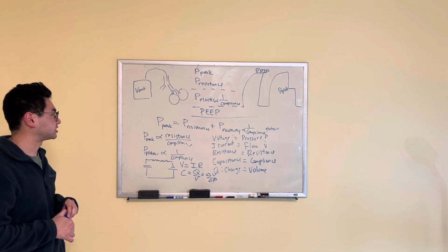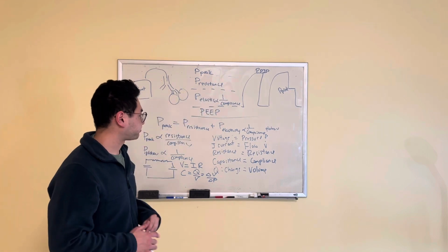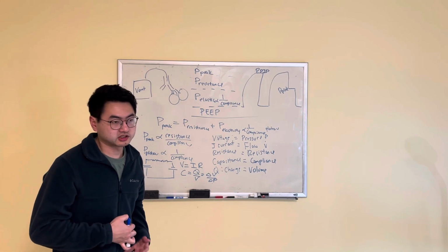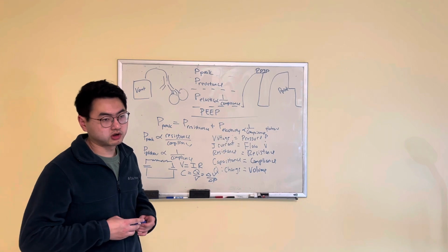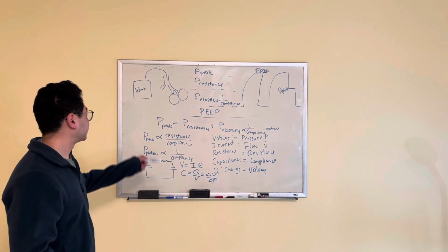That can help us when we're working with ventilators on volume control mode to figure out if the patient is going into a compliance problem, if their ARDS is worsening, if they got a surgery, if they've gotten an abdominal compartment syndrome.